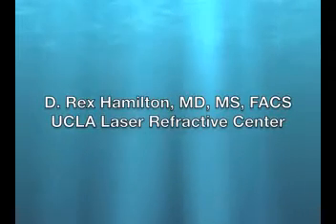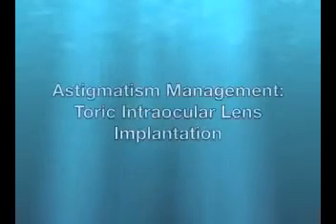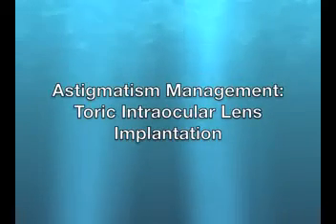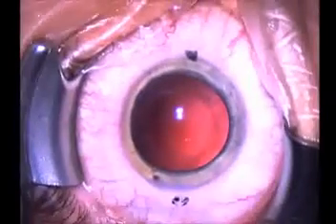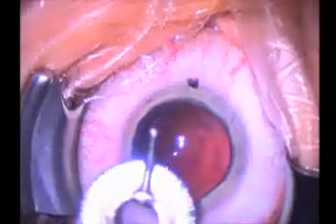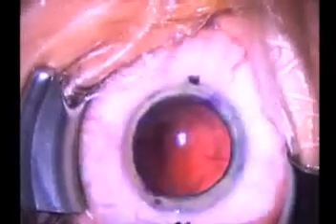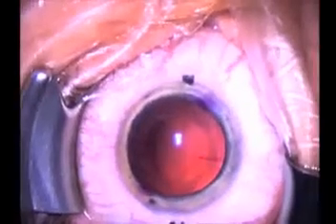This is Dr. Rex Hamilton of the UCLA Laser Refractive Center. I'd like to share with you the implantation of a toric intraocular lens for the treatment of astigmatism. 35 to 40 percent of patients have significant astigmatism that affects the quality of their vision. It is very important that this is treated during cataract surgery to provide the best uncorrected vision.